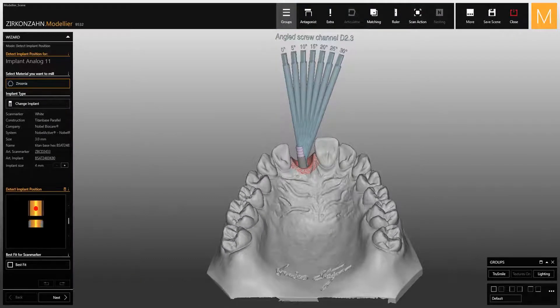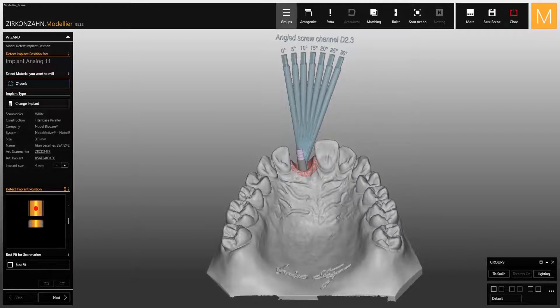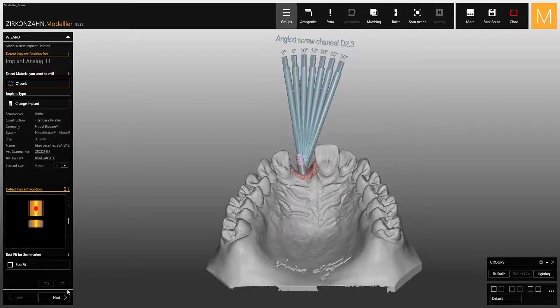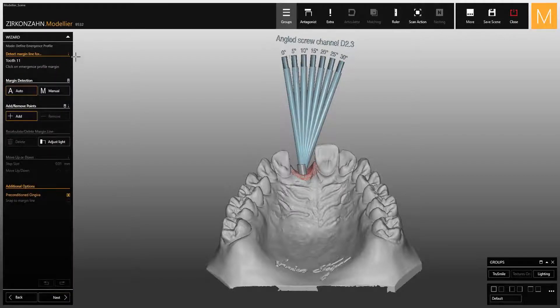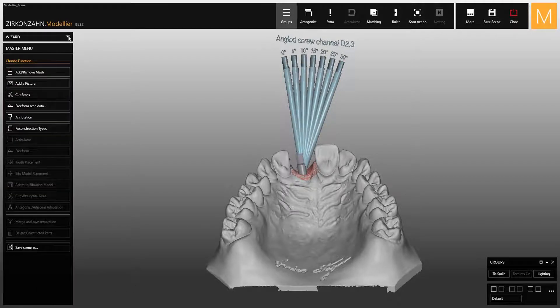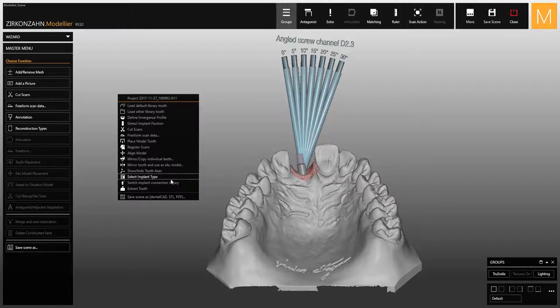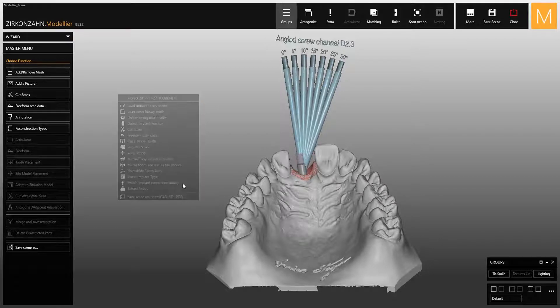It may happen that the screw channels are oriented in the wrong direction. In such cases, to change their orientation, go one step further, exit the wizard and click on the background, or directly on the implant parts if there is more than one implant. At this point, a window opens with several options.